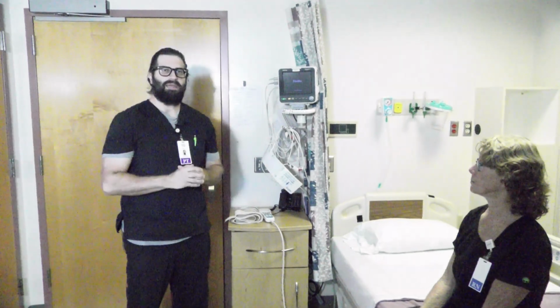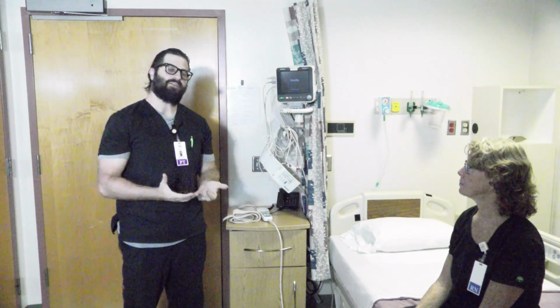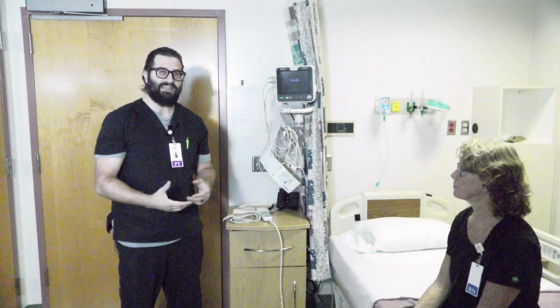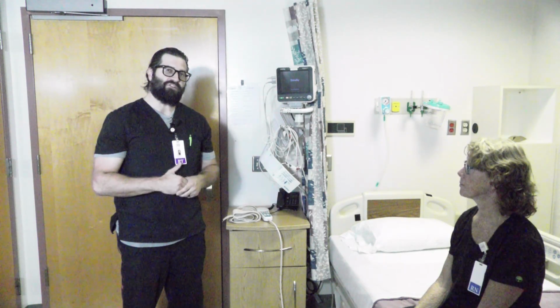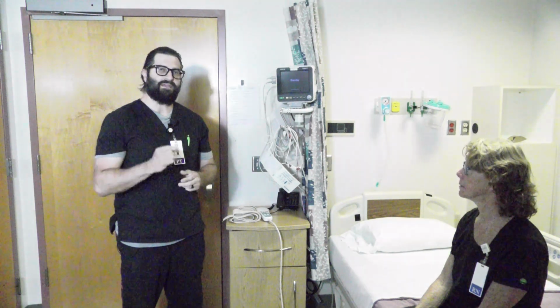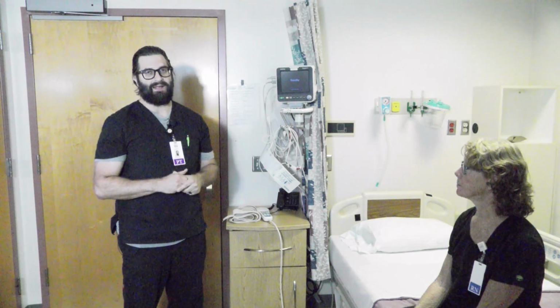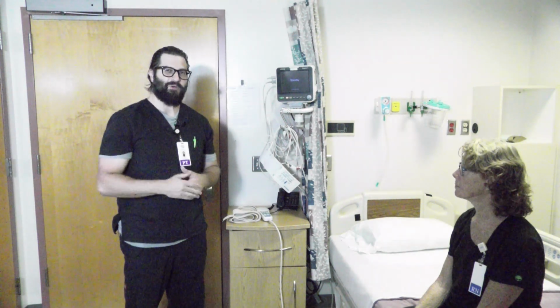So I'm here to demonstrate the proper use of a gait belt when you are transferring an individual or having them stand up so that you can do some linen change or some hygiene with them. Please make sure that when in doubt, you definitely use a transfer belt. They take a little extra time, but it can be well worth it to protect your back and to give you a long life working in the healthcare industry.